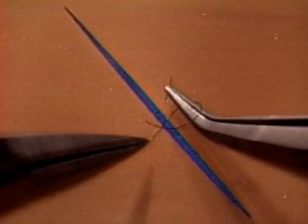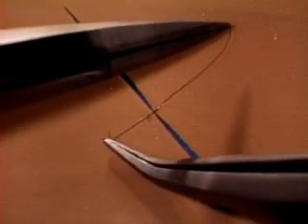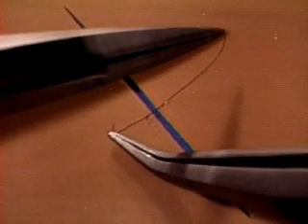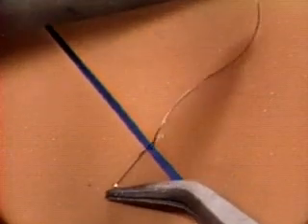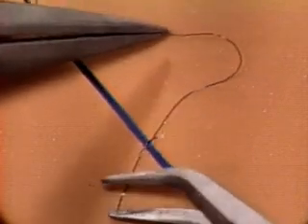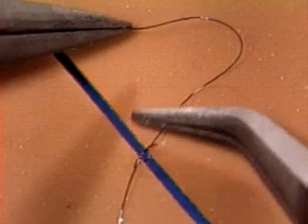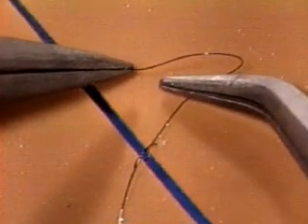3 things to notice here. First, you do cross your hands over, or rather your instrument tips, as you complete the half knot. Don't let that upset you. Second, you don't attempt with the first half knot to bring the wound edges together. That's a waste of time at this stage. We'll talk about the final tightening in a moment. Third, having completed the half knot, you definitely do not let go with your left hand, because from this position you lead straight into your second half knot.